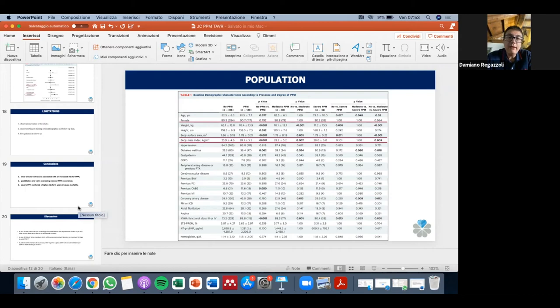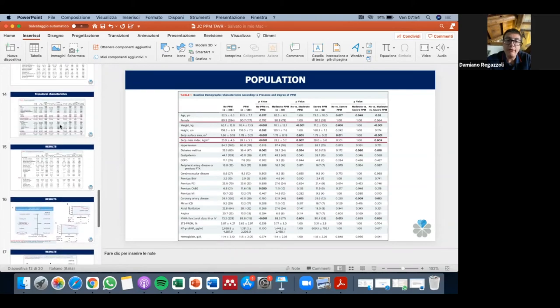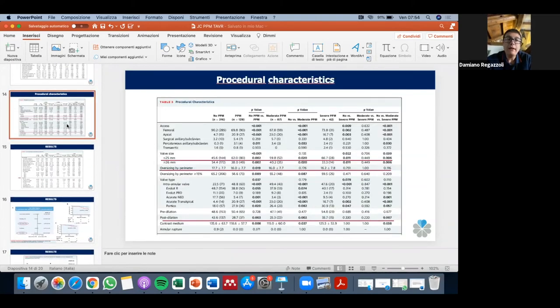And in fact, even if you add the balloon expandable valves into the equation, supraannular will end up going better than intraannular. So Portico and Sapien a little bit worse than Accurate and CoreValve Pro and R. And balloon expandable is not the solution, because it's not outperforming Portico in this specific setting, small aortic annulus. So probably in this setting, you have to go supraannular.